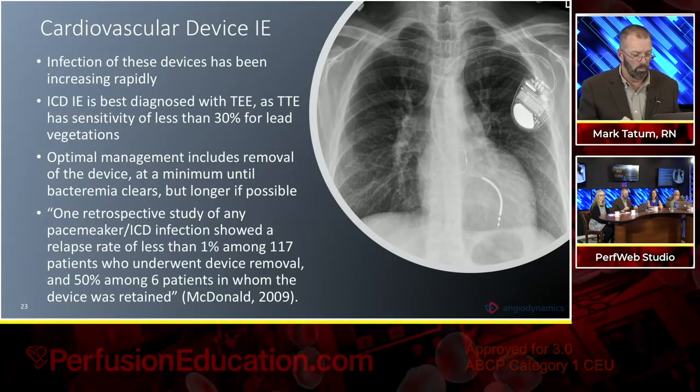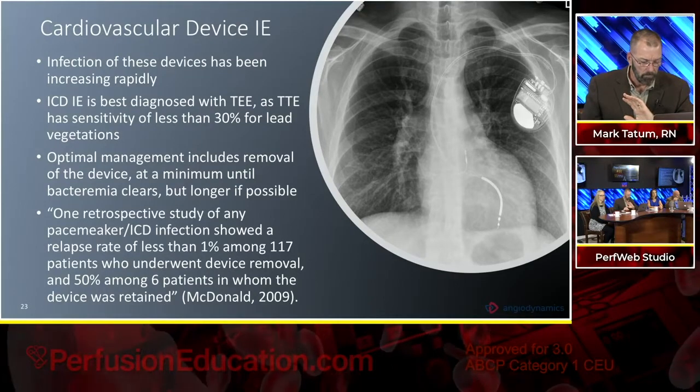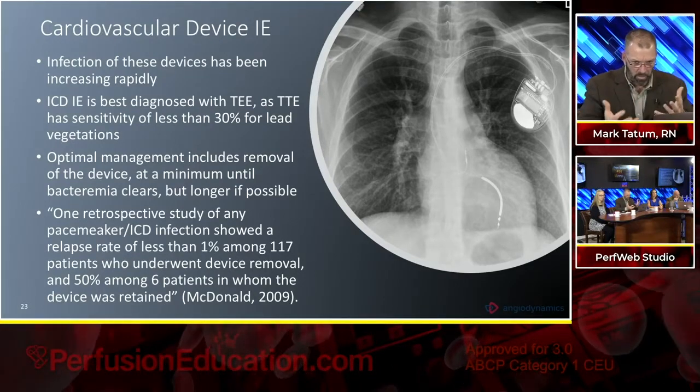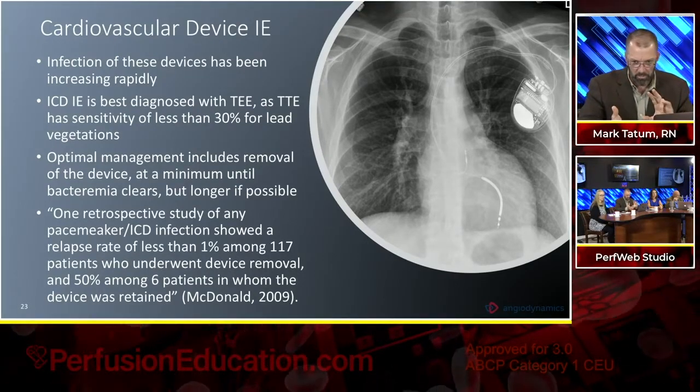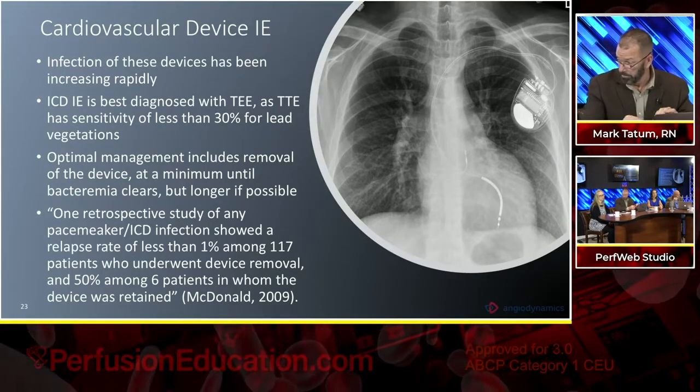So what I want to do a little bit is just kind of go through what our goal is, right? Today, whenever you identify material on a pacemaker lead, one of the things they like to do is something that I like to call pull and pray. Pull the lead. Pull and pray.